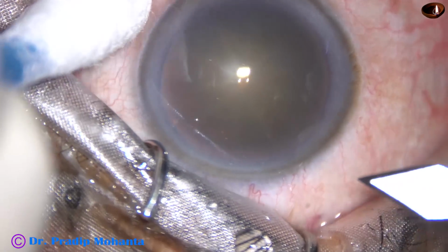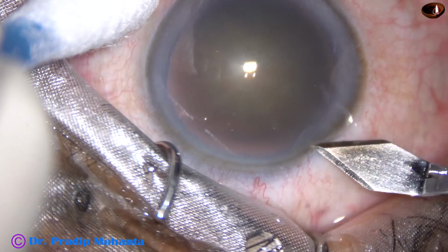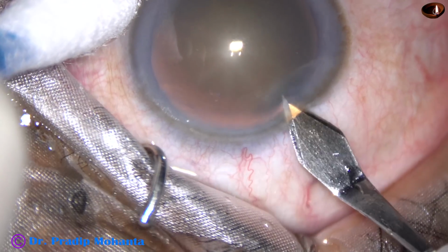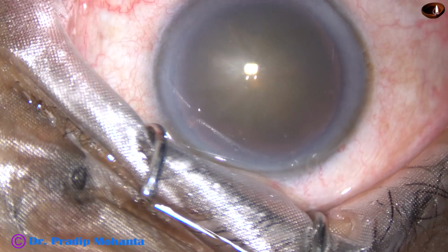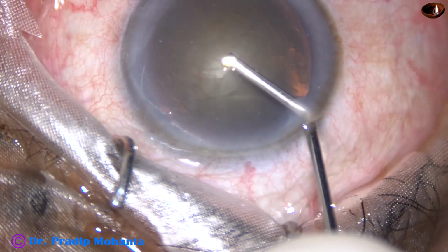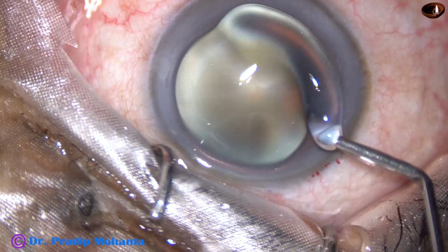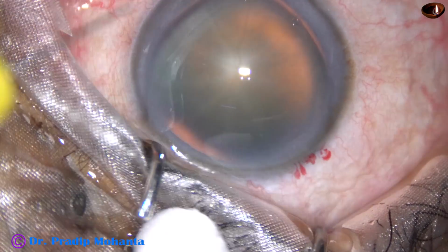Posterior capsular rent occurred in this surgery. Let us see how it happened and how it was managed. This is a routine phacoemulsification of a cataract with grade 3 nuclear sclerosis, and I didn't expect any problem in this case. But man proposes, God disposes.